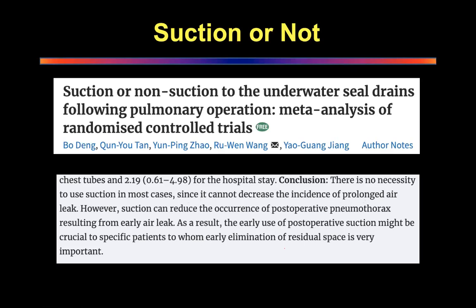The important thing is the suction has to be right. If you are getting a wrong suction, which means that your suction is not on, then you are creating a completely blocked tube, if you know what I mean. If it is without suction, at least it's open to air, and any collection in the chest will drain out through an open channel at the other end.